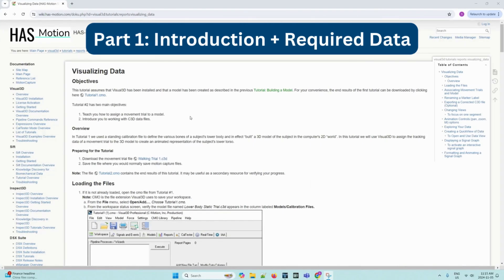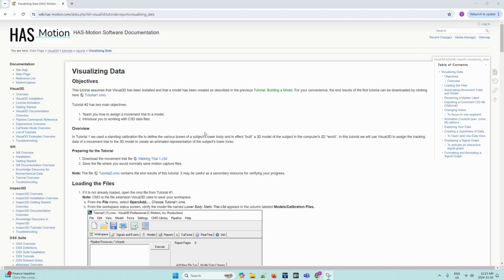Hello everyone, welcome to the HasMotion YouTube channel and second tutorial video on Visual 3D. This video will cover visualizing data. It has two main objectives. The first is to teach you how to assign a model to movement trials, and second is to introduce you to working with the movement trials.